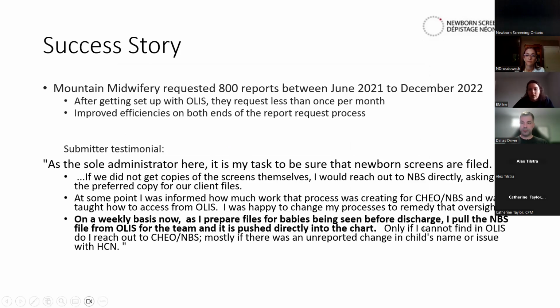And so now they only request when they're unable to find in OLIS, for example, if they don't have a health card number, they won't be able to find them in OLIS, but I'll just give a minute so everybody can read this testimonial on the screen. But just to highlight, it improved the efficiencies on their end as well as our end.